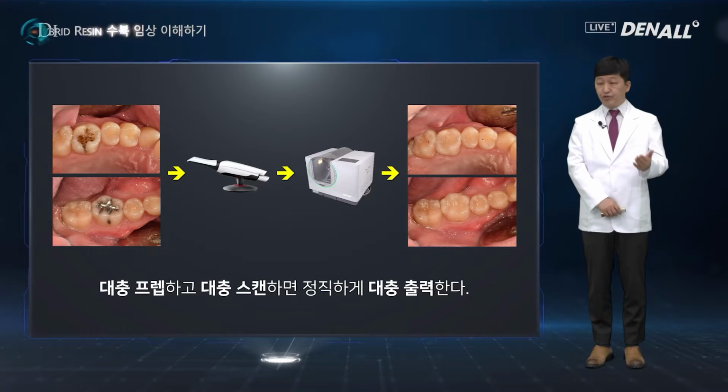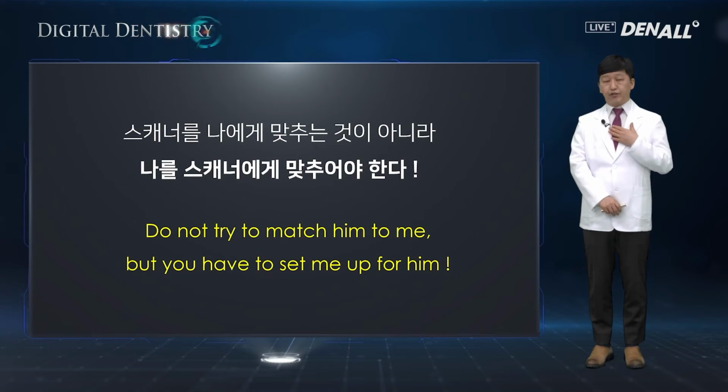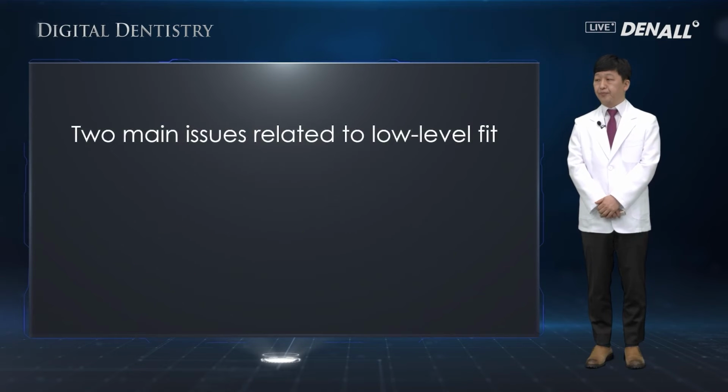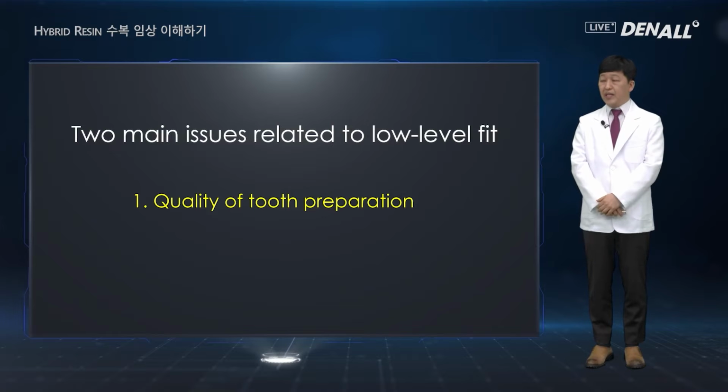If you prep and scan half-mindedly, unsatisfactory restoration will be printed out. There's a high possibility that it will not fit. Digital dentistry, you cannot make the scanner customized to me. You need to customize yourself to the scanner. When you do inlay, if you use digital dentistry and provide good inlay, there are two reasons why low-level fit problem occurs. The first is quality of tooth preparation. This will inevitably lead to low-level fit.